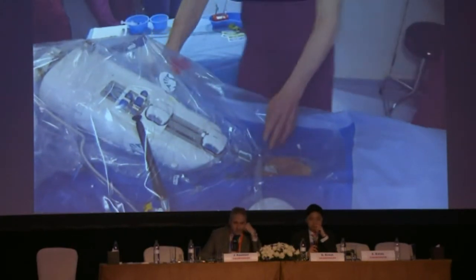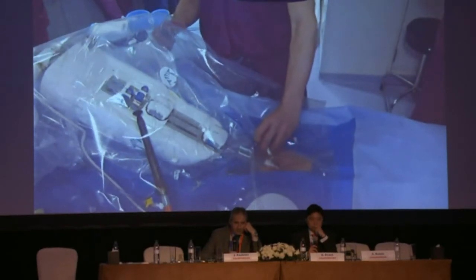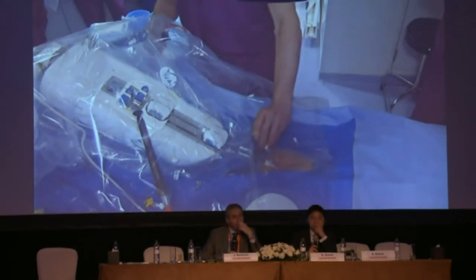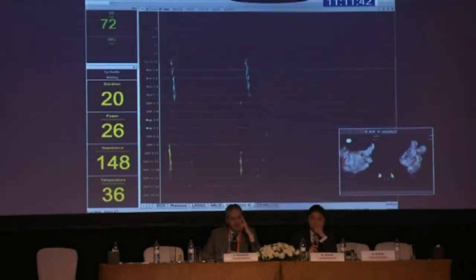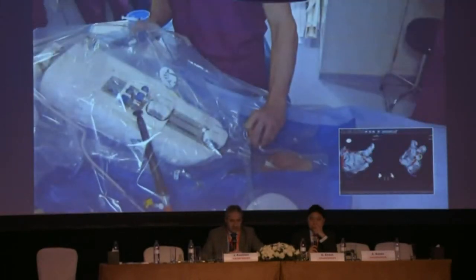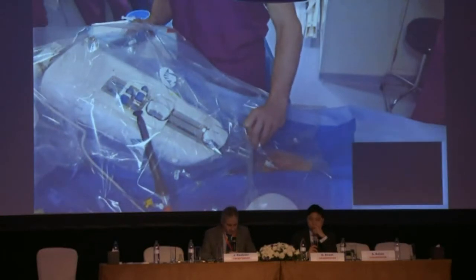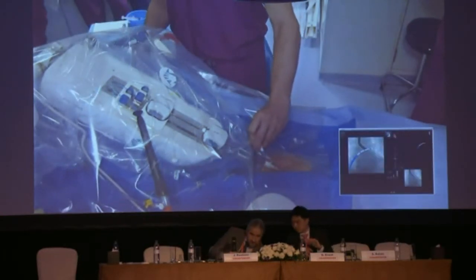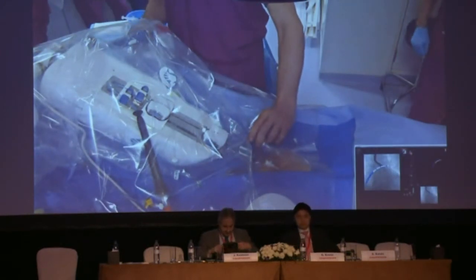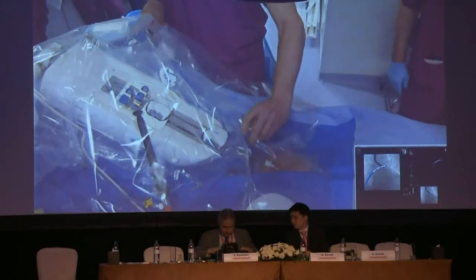So I was partly using the PV and CS signals. As I mentioned before, it was CS distal to proximal, so I know it's unlikely to be coming from the posterior septum. I saw that the appendage signal was earlier than the CS distal, so it was more likely to be coming from anterior, somewhere between the CS and the appendage. And then I put my mapping catheter septal of the appendage, and I was looking at the relative timing of the distal and proximal.